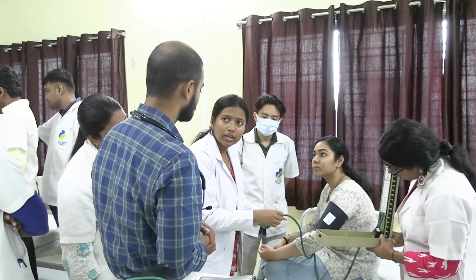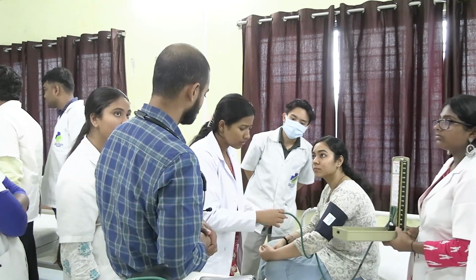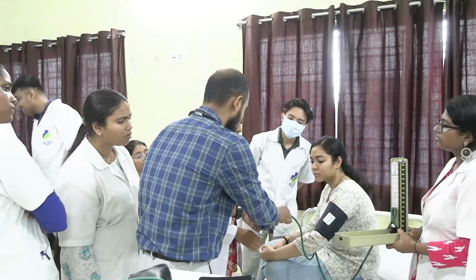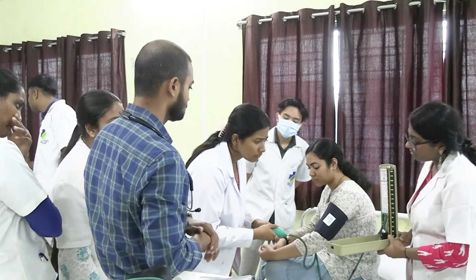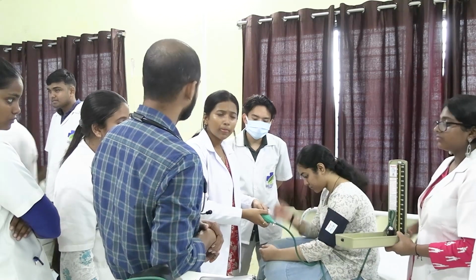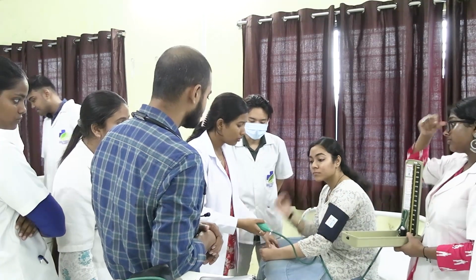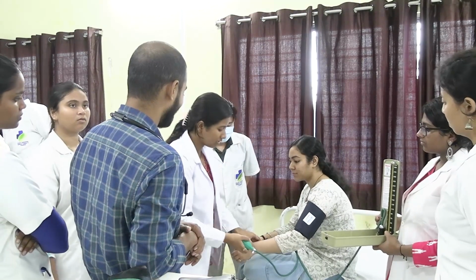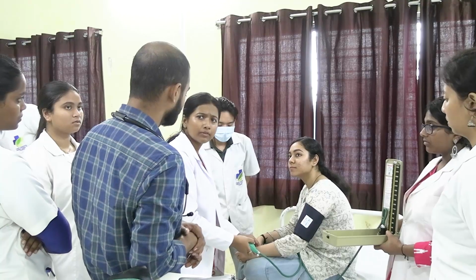So how much should it be tightened? Fully, not too much. Okay, it is tightened. Now what will you do? Now we'll press it. Before pressing, find the radial pulse. Where is the radial pulse? Have you found it?